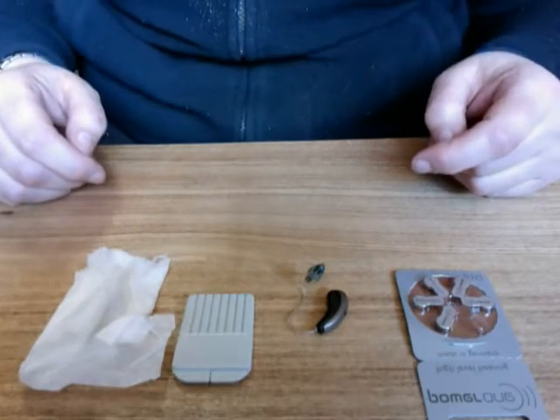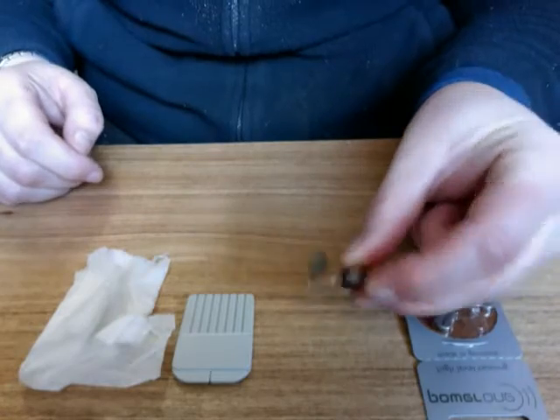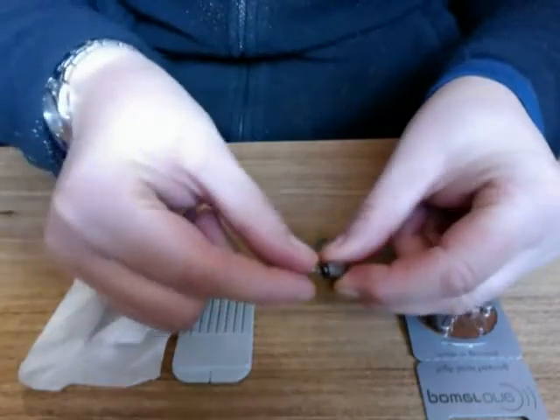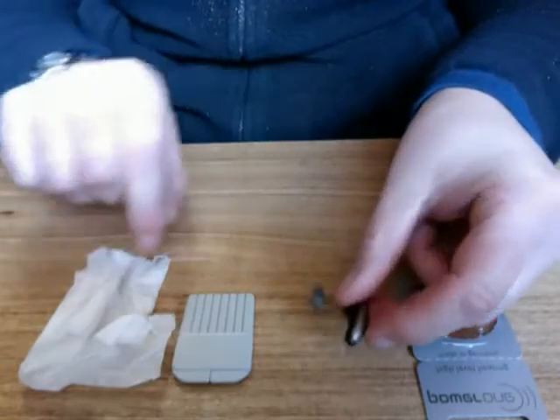Today we're going to look at how to clean a receiver in the canal hearing aid. This is a hearing aid that has a small wire and speaker rather than an empty tubing.